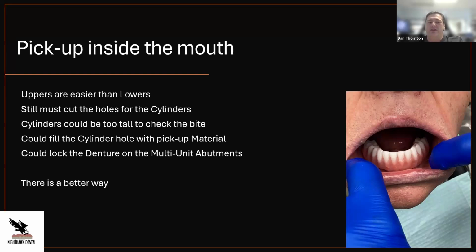If you're doing a traditional way with the freehand, you're used to picking up a denture, like a soft reline or like a nice wash impression. So you're used to setting that bite to the opposing dentition. It's in a way why I like the freehand sometimes a little bit better, just because we can permanently set that bite easier by just kind of manipulating the jaw a little bit when the patient's still sleeping and setting them in that bite that they should be in.